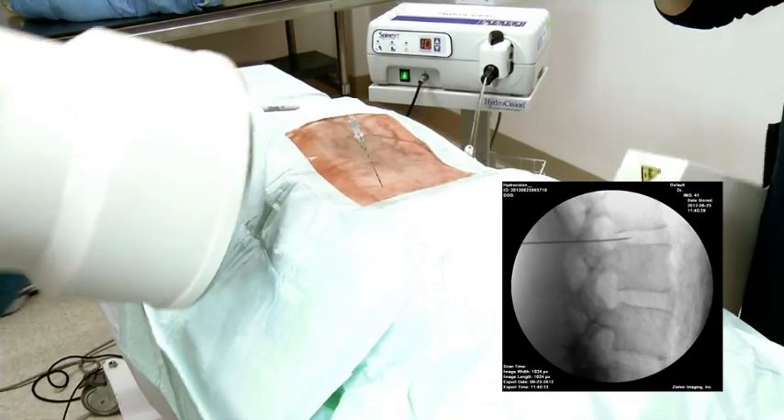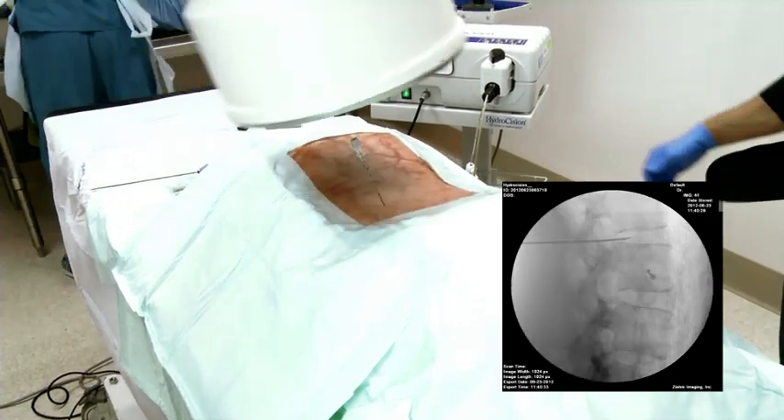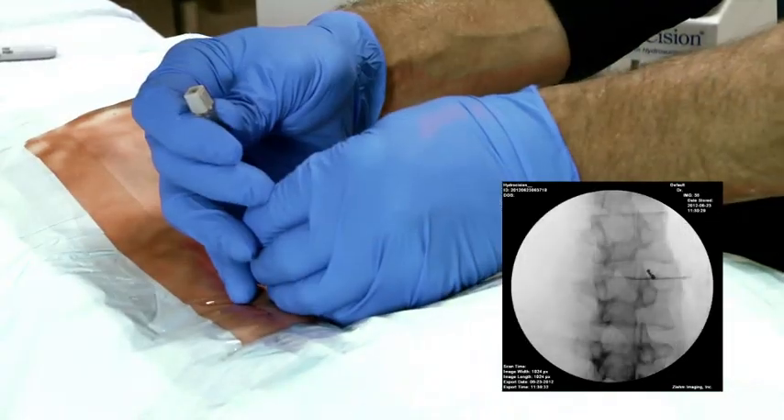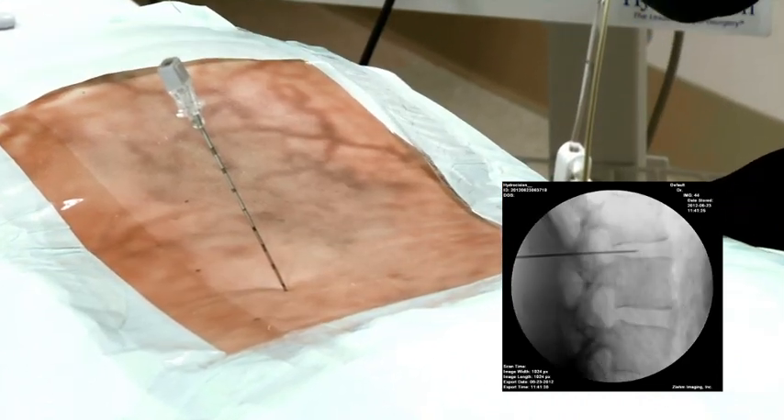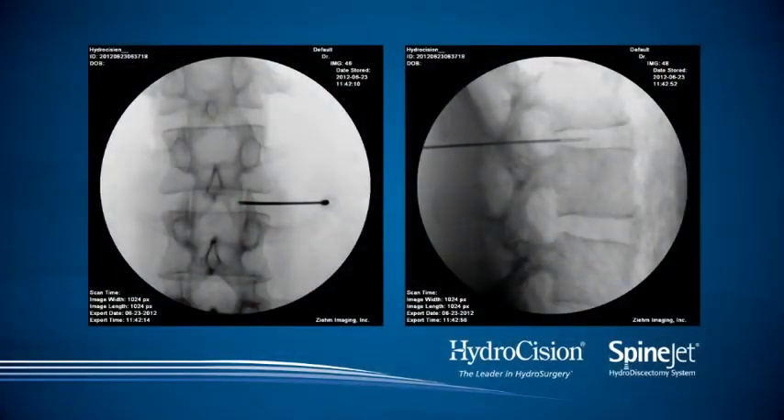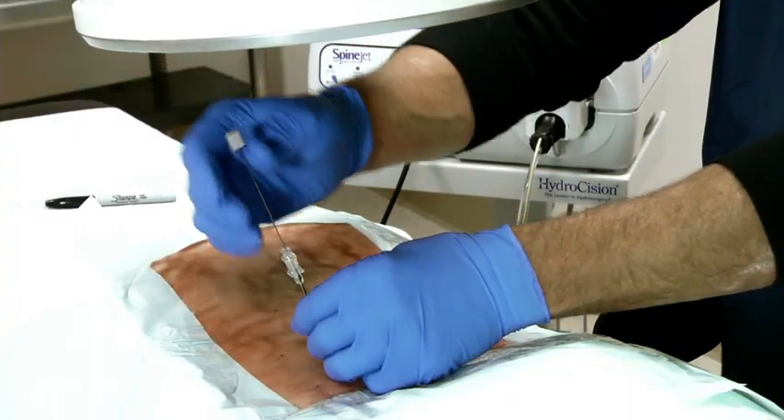Using first lateral, then intermittent AP and lateral views, continue to advance the needle until it is approximately in the center of the nucleus, midway between either end plate. Confirm placement and remove the stylet from the needle.